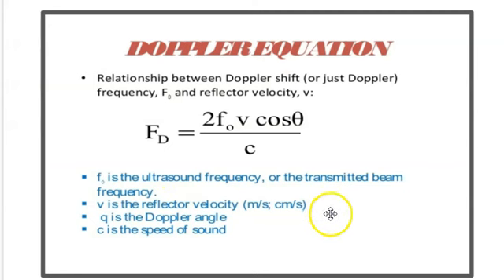This is the Doppler equation. You're not going to have to know this Doppler equation for test purposes, but as I explained in class, you're going to have to understand what the Doppler equation is and how to use it to your advantage on the test, how it's used in Doppler acquisition, if you will.